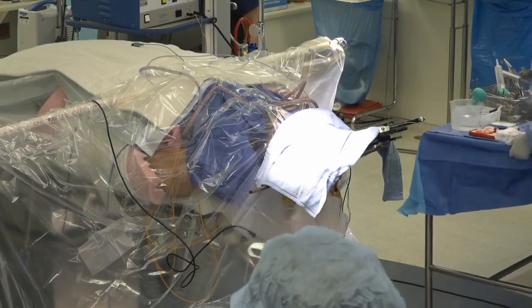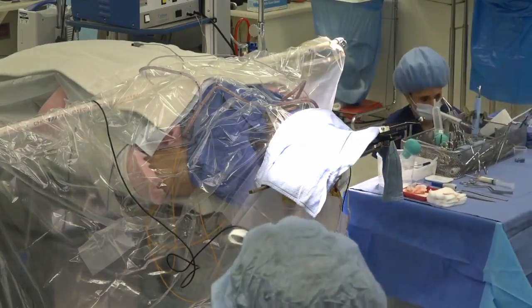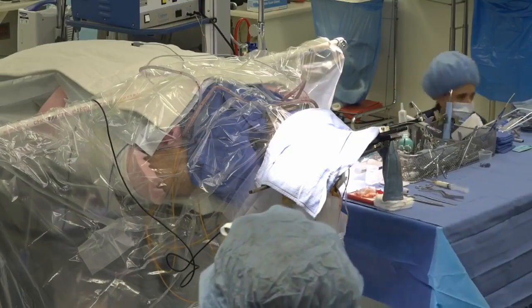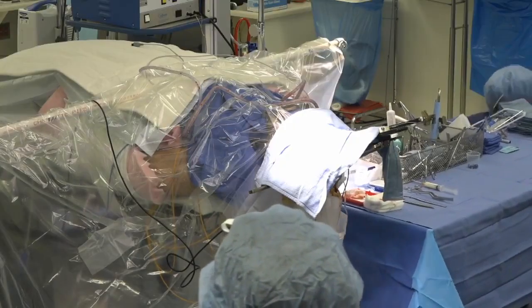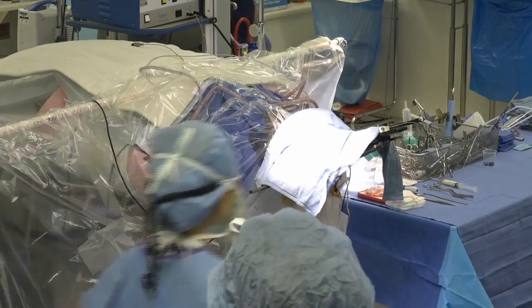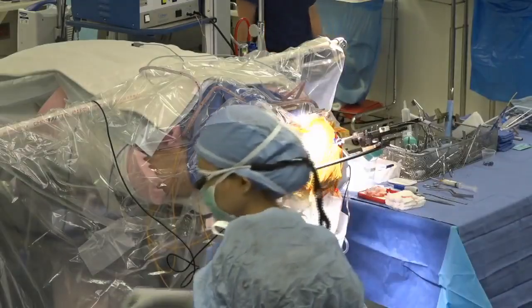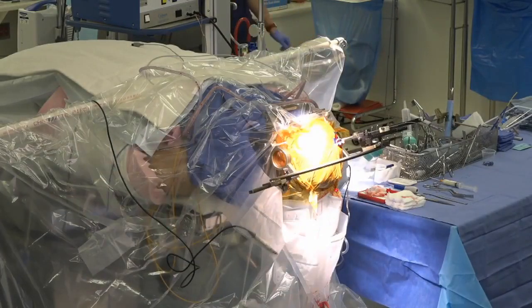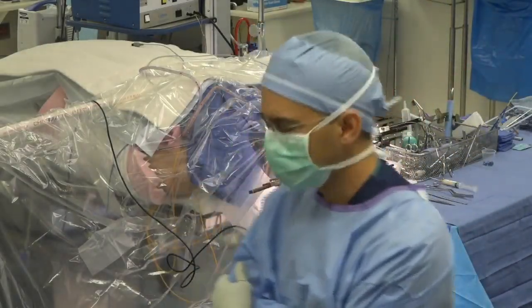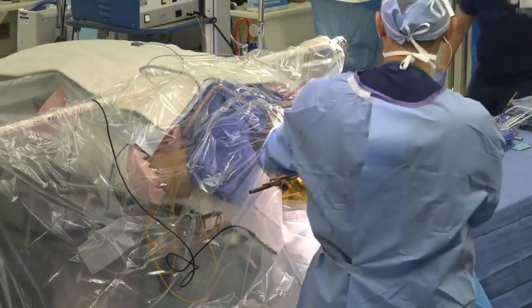But just like how this operation evolved from ablations, destructive procedures on the brain, even the microtrauma from the operation can sometimes result in what we call the honeymoon effect, where after the operation, their symptoms may improve, albeit temporarily, just as a result of the micro swelling that is a reaction to placing the wire. But yeah, typically people go home the morning after surgery.